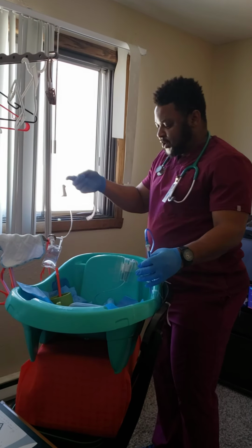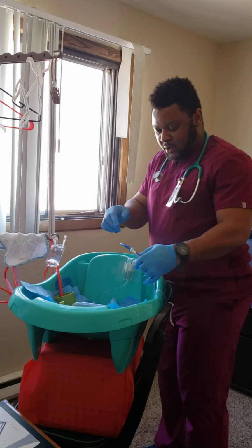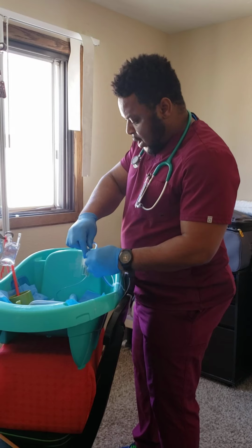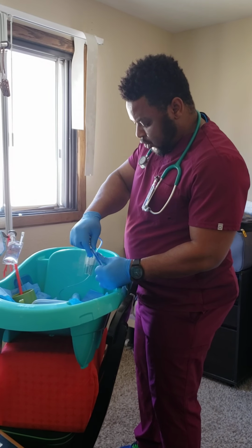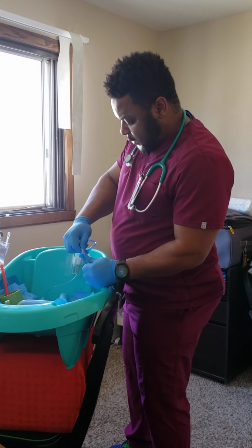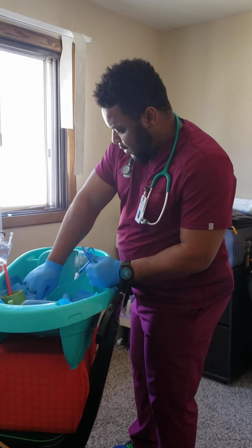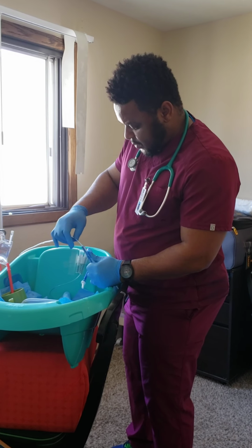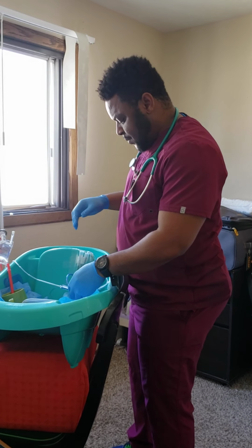So this is my suction machine right here. I want to put my suction machine on, and as I put my suction machine on, I will clamp my tube. I clamp my tube at the bottom. I'll take this off. Take my suction machine and connect it to the tube.